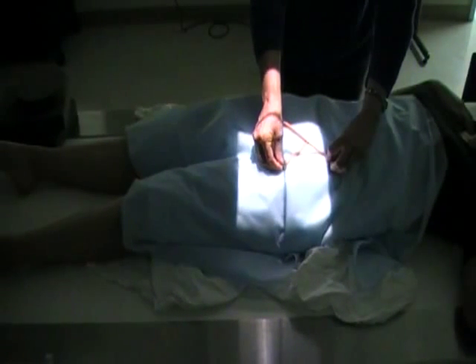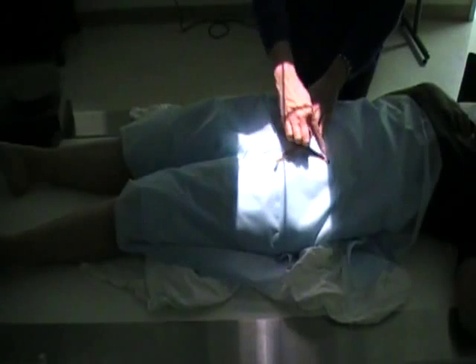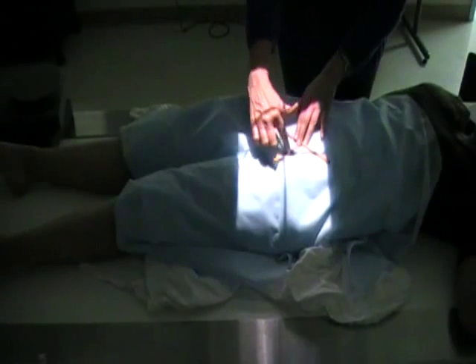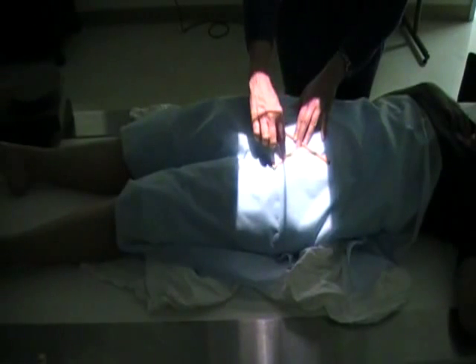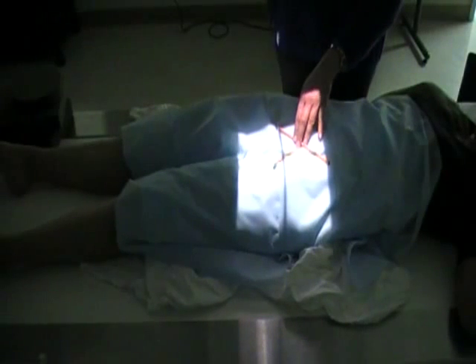Actually, you'll be doing this visually without having all of this set up. But you want to have a perpendicular line coming from this main connecting line from the ASIS to the pubic symphysis. 90 degrees from this line, you're going to have to go down 2.5 inches if you want to be centered over the neck of the femur. 1.5 inch indicates you're over the head of the femur.